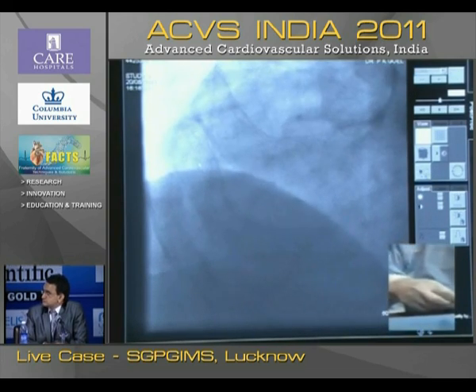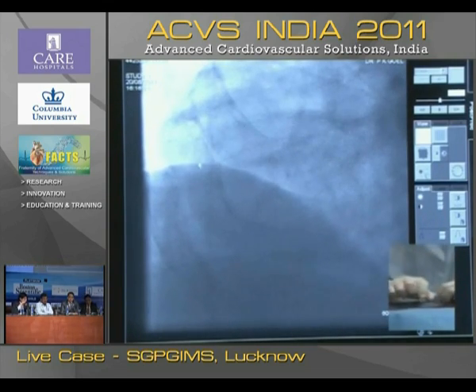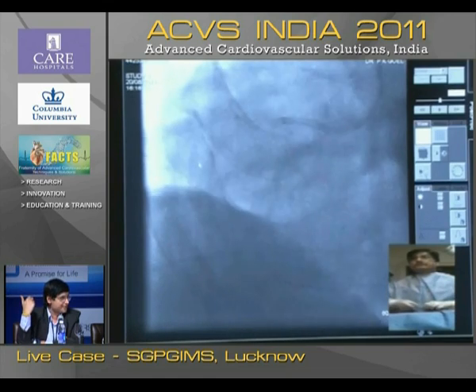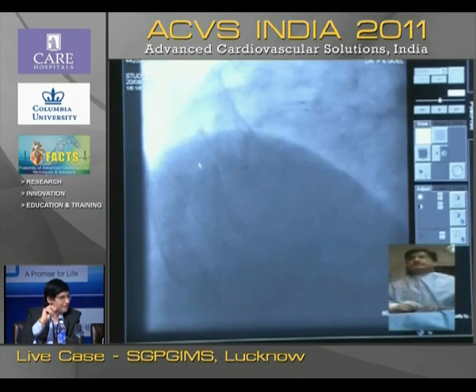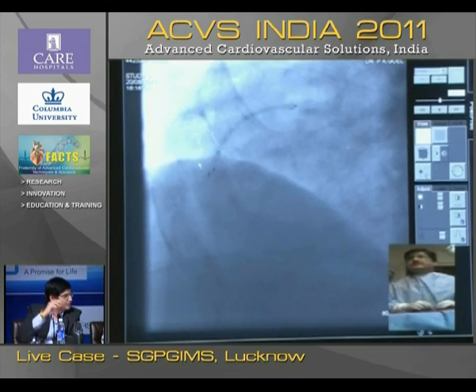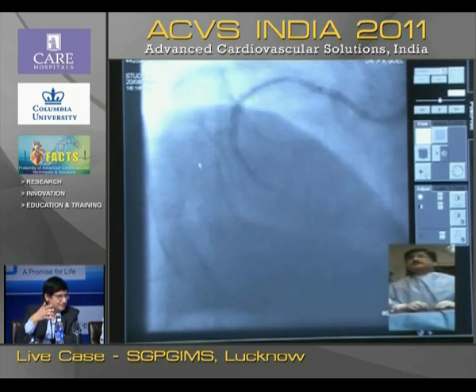Actually, here the tactile feedback, why is it important? Because if the hardwire is stuck in the heart tissue, it will penetrate and may perforate the vessel and push out the catheter also, the guiding catheter. That's why tactile feedback is always necessary whenever you are using a hardwire. And whenever you have hydrophilic wires, you won't get tactile feedback. It easily goes through into the false lumen. That's why a microcatheter is preferred to OTW. Initially OTWs were used, but nowadays everybody is preferring microcatheter only.